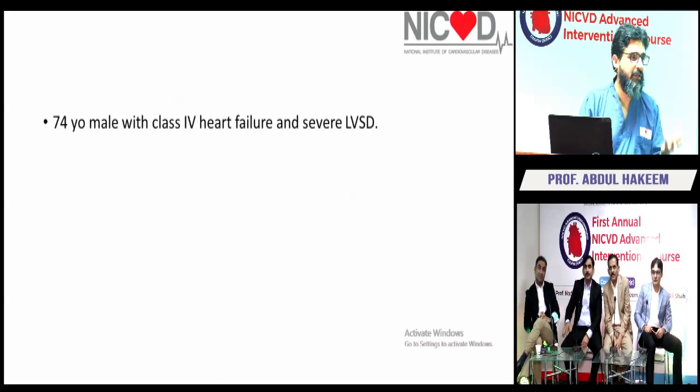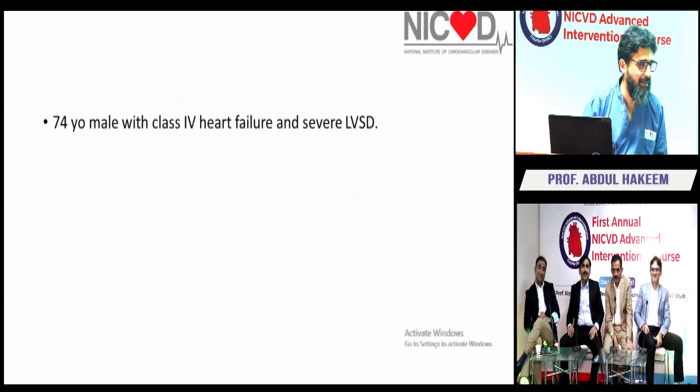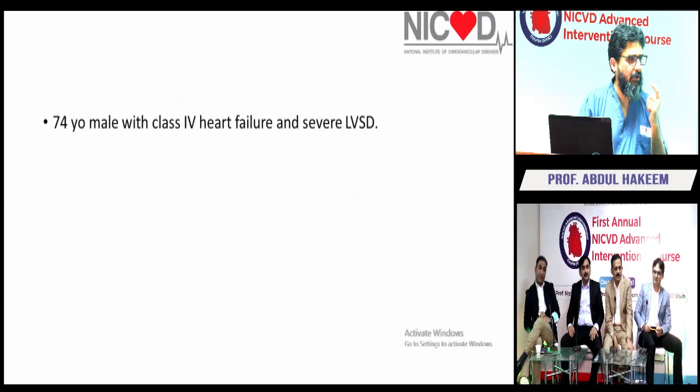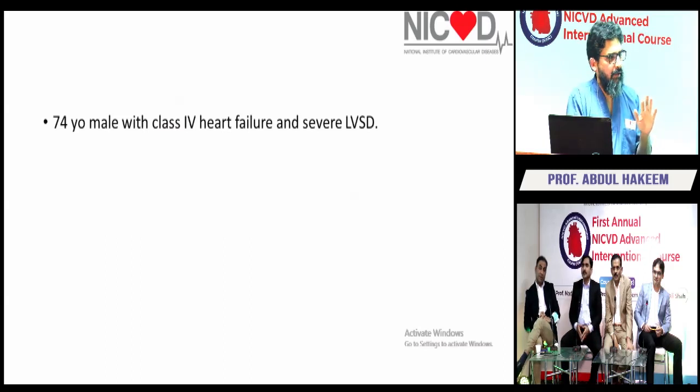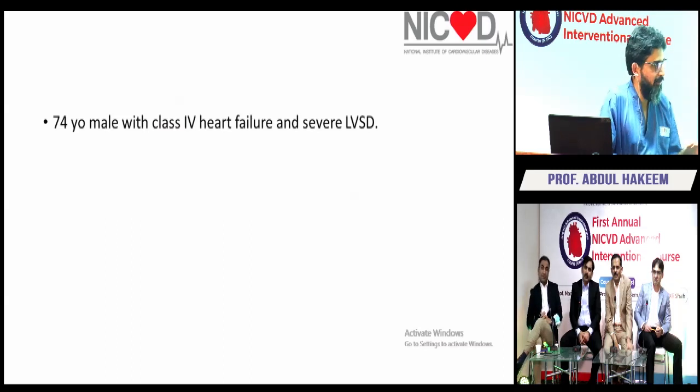Yeah, so very first thing you want to do is what? Put a probe on the chest, and more importantly, make sure the valve is still in place, the valve is not embolized, okay? That's the problem with these self-expanding platforms. And at the end of the procedure, when they said, oh, the mean gradient is about 4 or 5, now we were getting a gradient of close to 40, 45. So what the hell happened? Okay, the patient got a suicide ventricle.